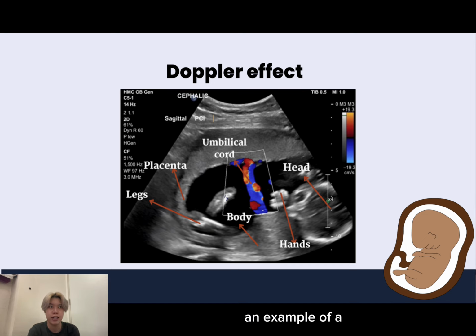Color Doppler imaging is frequently used in medical ultrasound to show blood flow. The various blood flow velocities are given colors by the Doppler effect. Red, for instance, might indicate flow in the transducer's direction, which is positive Doppler shift, whereas blue might indicate flow in the opposite direction, which is the negative Doppler shift.